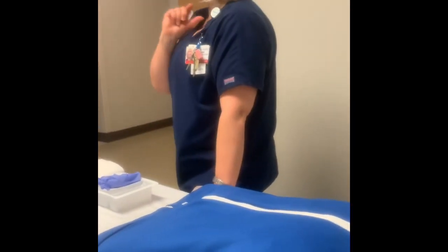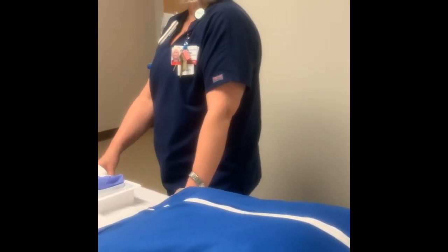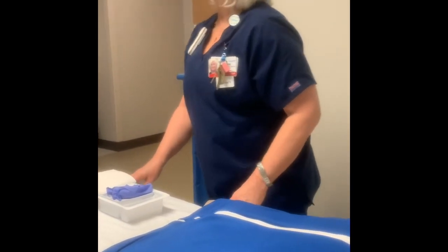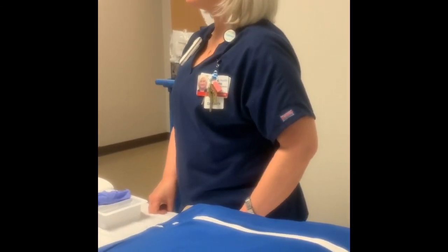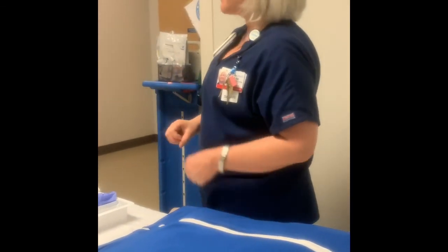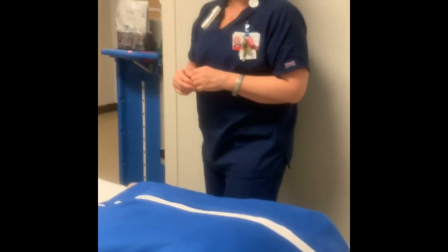I don't know if you remember the old metal ones. I was just thinking, yeah. We used to have them. Those I didn't like. During treatment too, we'd have to have them take it out before treatment because of all that metal, and it would cause more reaction. And one of the things I never understood was when they were getting ready to try to wean somebody off, they would put what they called a Jackson trach in them. I don't know why. What's a Jackson? I haven't heard that. It was metal, a metal trach. Yeah, they called it a Jackson trach. Okay. Yeah, that was years ago though.